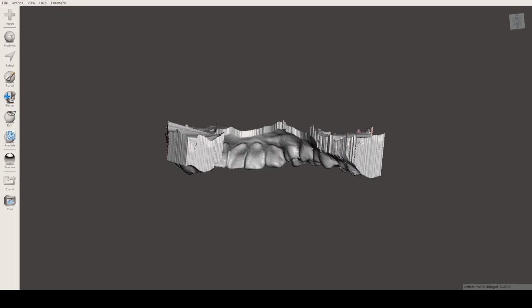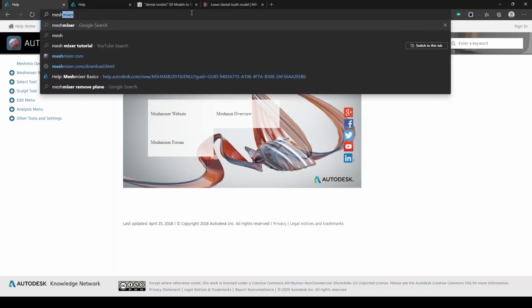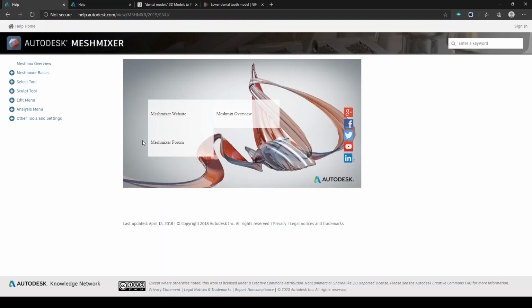Another thing you can see up there is the menu. You have the file menu, actions menu, view, and help and feedback. The help menu will just point you to the manual, which you have on the website. Meshmixer's website has the manual itself. If you click here, it will redirect you to the Meshmixer manual.